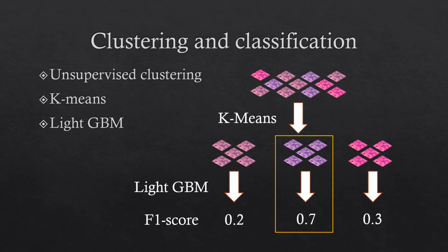It is desirable to collect only patches that provide information to distinguish tumor type of patients. However, the ROIs of tumors were not provided in this challenge. We came up with an unsupervised clustering method to distribute the patches into several groups. The next problem is, how do we choose a right group which could include the most tumor types? Our solution is to select the group by evaluating the classification performance of each group. First, we use k-means with cluster size 1 to 6 and the 2048 or 4096 image features. Then we train classification models using LightGBM for each group and evaluate the prediction accuracy of all the models.